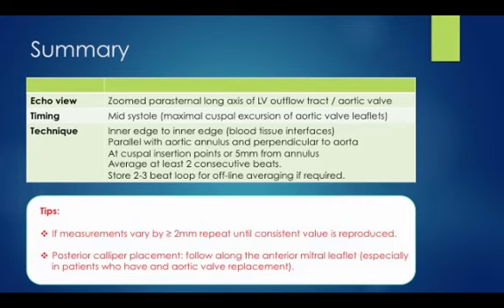After demonstrating to the students, I would ask if they had any questions. I would answer these questions if they had any. I would then use this table to summarize the content, with the answers hidden until attempted by the students. I would ask questions such as, what is the echo view we are using to measure the LV outflow tract diameter? How are we determining the mid-systolic frame?